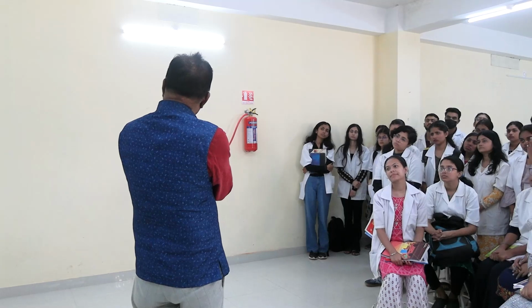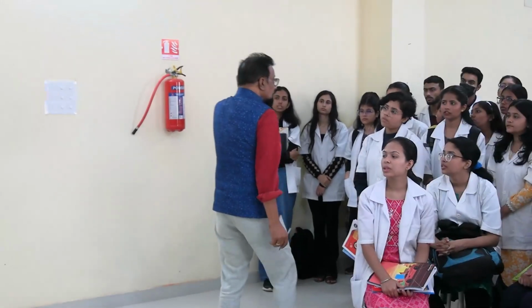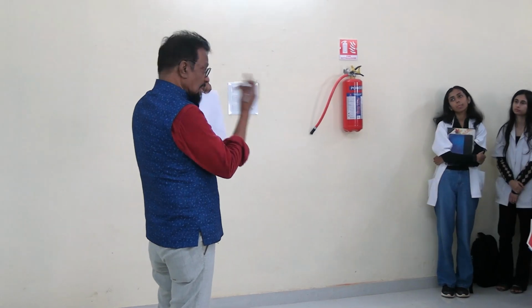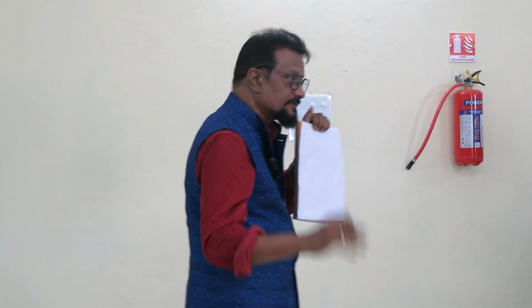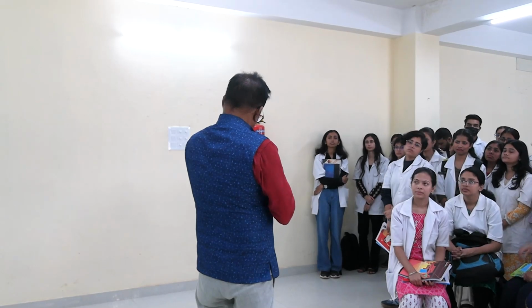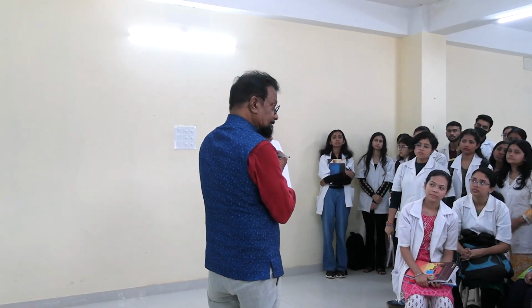I'll be studying 100 what? Neutrophils. So out of this 100, some will have 2 lobes, some will have 3, some 4, and some 5 and 6. Let's see their numbers. I have studied 100. Out of this 100, my 4-lobed count is 40.